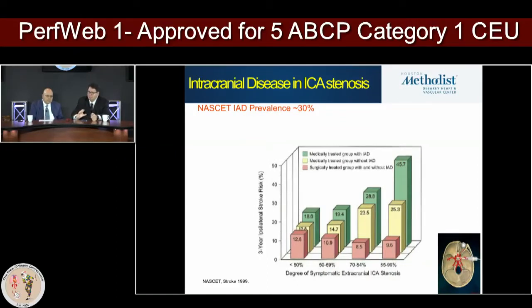So I think these are really scary numbers. These numbers are also associated with extracranial stenosis, and we do screen for carotid disease before we go to the cardiothoracic surgeries. The carotid ultrasound screening is just not enough, because the carotid is here, but the carotid doesn't end up here. The carotid really hooks to the middle cerebral artery behind your eyes.